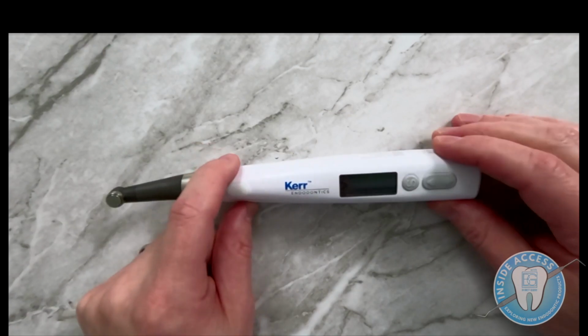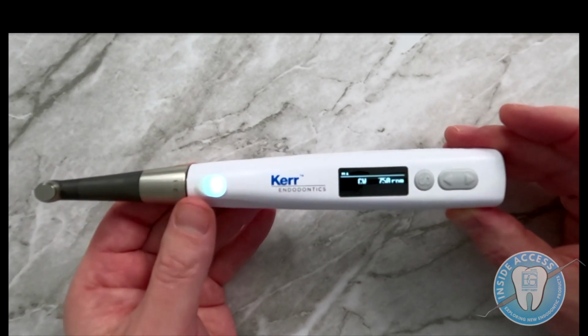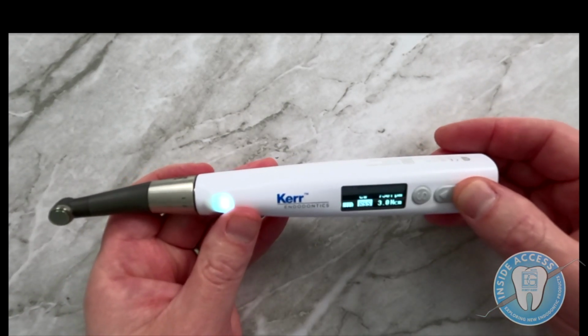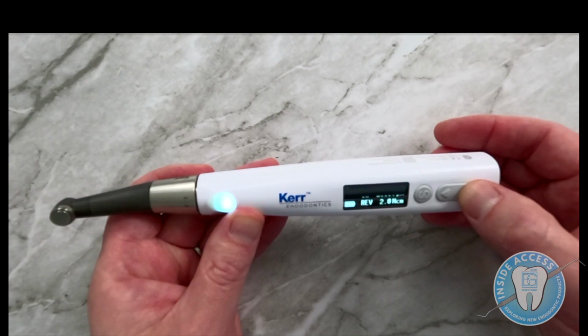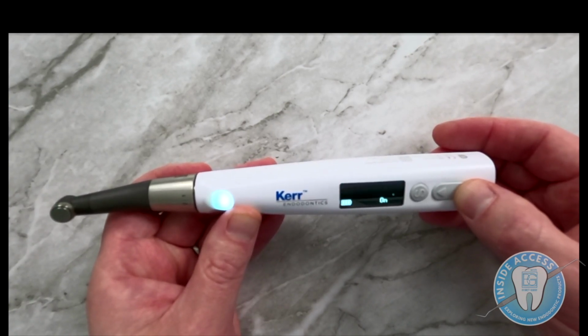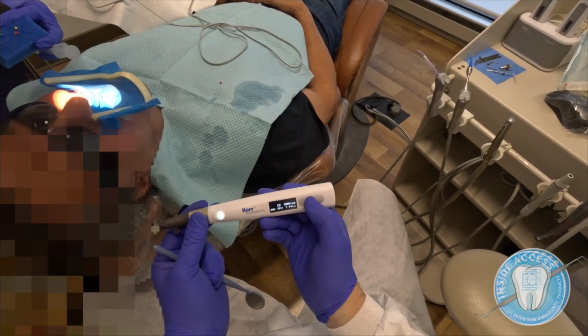Okay, so I'm back here with the Elements Connect, the cordless motor, and I'm going to fire it up. And again, the screen doesn't really blink like this, just the way that the camera is picking it up. So I'm at M1, and I'm going to go through Adaptive, M2, M4, Traverse Orifice, Traverse Glide Path, which works very well with this system, Zenflex, and then ultimately I'm going to get to Reciprocation.